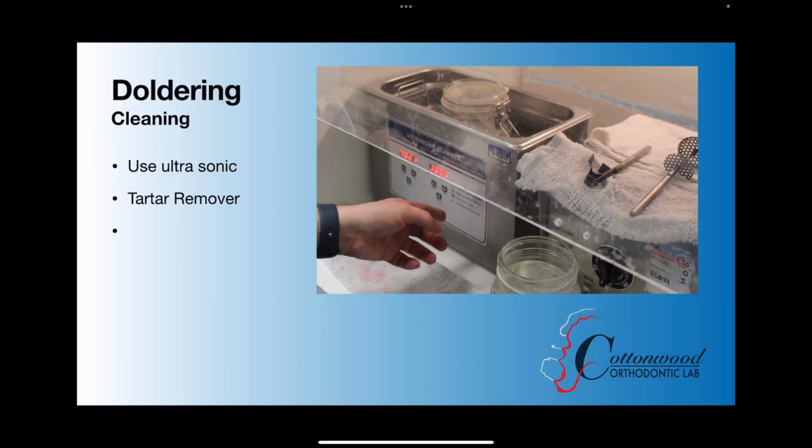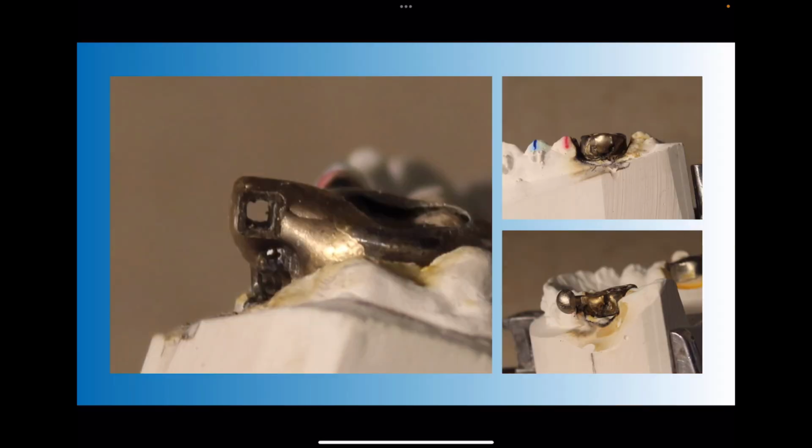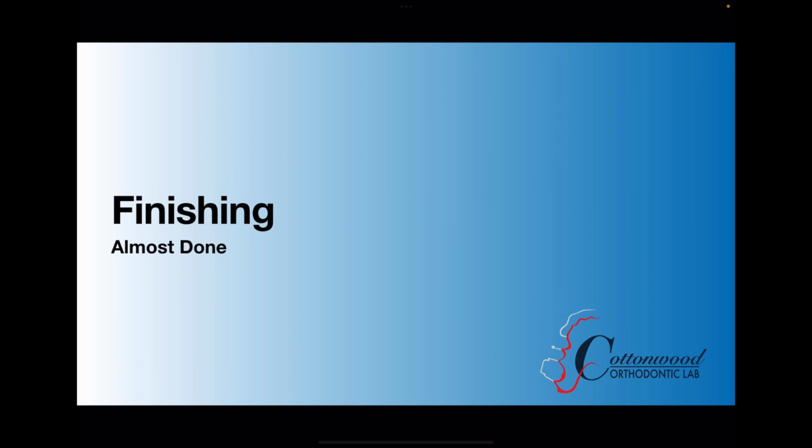There we go. Okay, so next after that, we like to use the ultrasonic, and we put it in a container with some tartar removal for about 5 to 10 minutes. This helps remove all of that carbon and anti-flux and any additional unused flux. So I'd like for you to kind of see what the final output is before we do any kind of finishing. If you notice here, it's pretty smooth. You can see how we've stacked that on and covered the tube. Super important to make sure you cover that tube, especially if it's an expansion case and you're going to expand first. They might bite on that tube and bend it if you don't cover it.